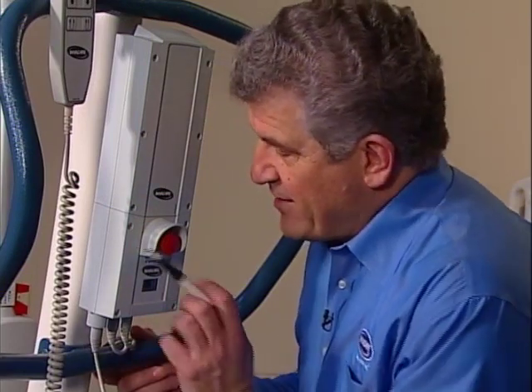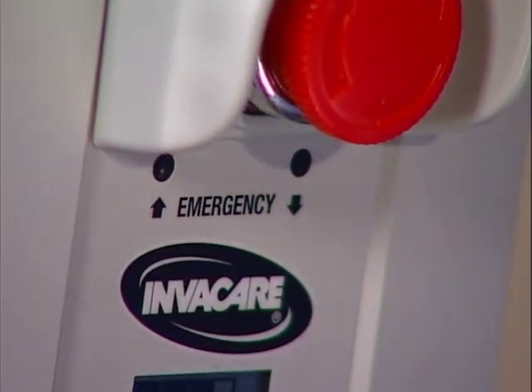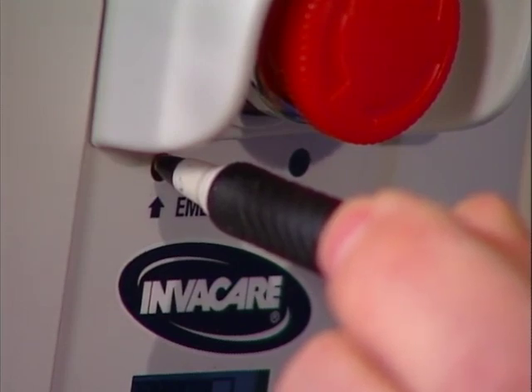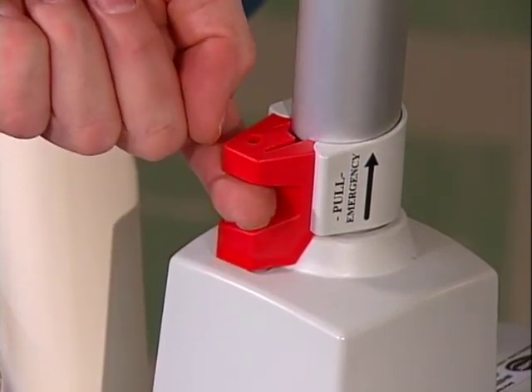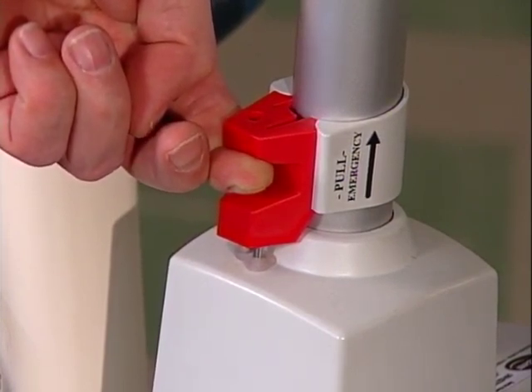There must be weight on the boom for this mechanical release to function. The primary emergency releases on Jasmine lifts are more sophisticated — they're on the control box, with an emergency up and an emergency down release. Like the Reliant release, insert a pen or similar object into the appropriate hole: up if you want to raise the lift, or down if you want to lower it. This will move the actuator independently of the hand pendant controls. The secondary emergency release on the Jasmine lift is located on the actuator. Pull up on the emergency sleeve — this will slowly lower the boom. There must be weight on the boom for this mechanical release to function.